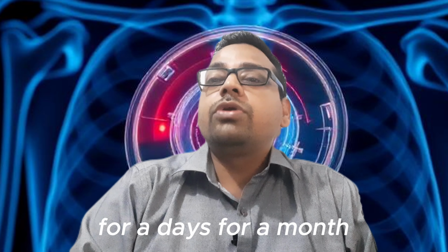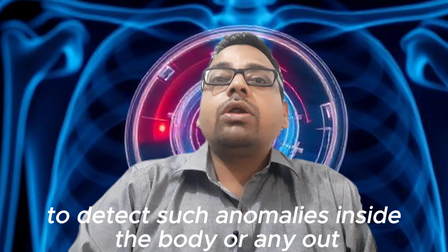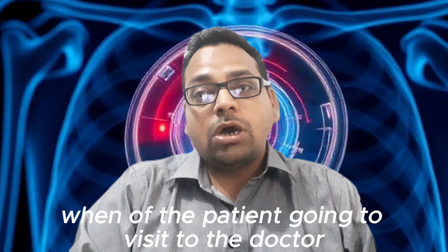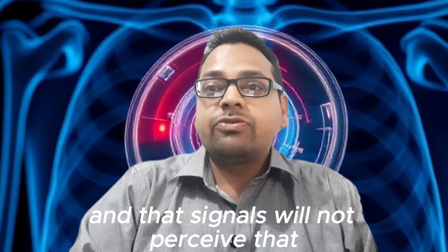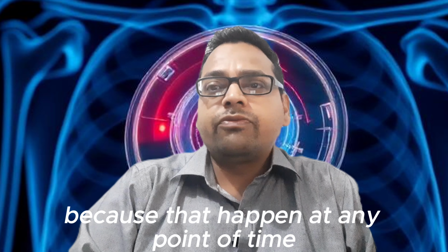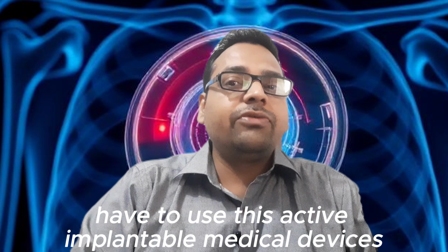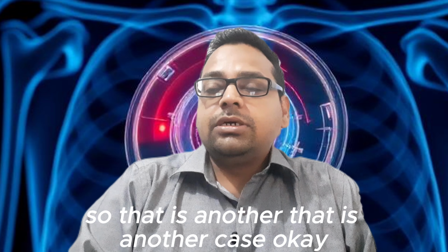They are implanted for a while, for days or a month, to detect such anomalies inside the body, or to easily detect the body symptoms. Because it may be possible that when the patient visits the doctor for a checkup, those symptoms and signals are not present and things do not get diagnosed, since they can happen at any point in time. So in that case, the doctor or clinicians have to use these active implantable medical devices for diagnosis purposes. That is the other case.